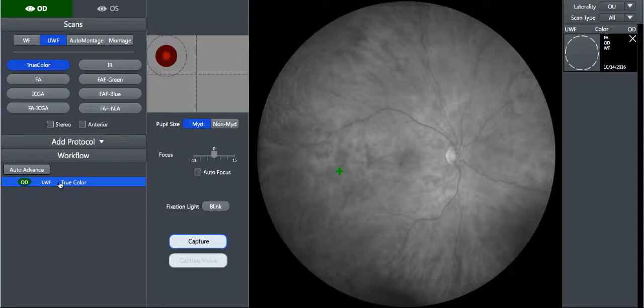For this demonstration, I'm going to capture a series of fluorescein angiography images instead of true color. So I'm going to change my scan type to FA, which we can see is reflected in my workflow, and I'm also going to change to the wide field setting to start with. This information is also reflected over here on the right side of the screen in the bin where the thumbnails of the images will show up as they are captured. This is the information known prior to image capture. After each image is captured, these metadata will also include a timestamp that is important to the interpretation of FA images. The next step is to align the camera to the eye.